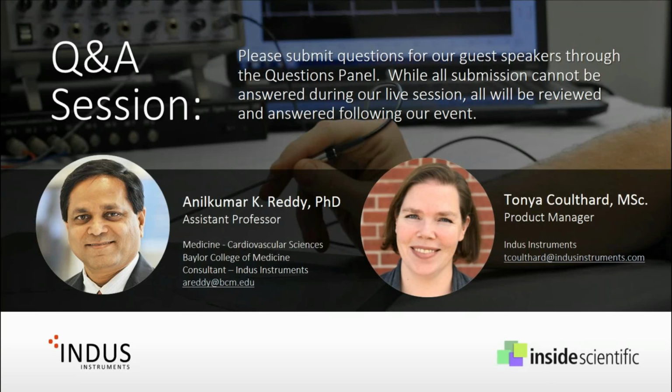So Anita, very similar to the rat approach, we'd select the probe which gives you the signal of interest. Whether it's the 10 or the 20 megahertz probe would depend again on how much depth of penetration we needed for those mice. I presume they're the obese model. And whether or not you had to change the approach, similar to the rat, where we come up through the suprasternal notch view and begin to acquire those images.